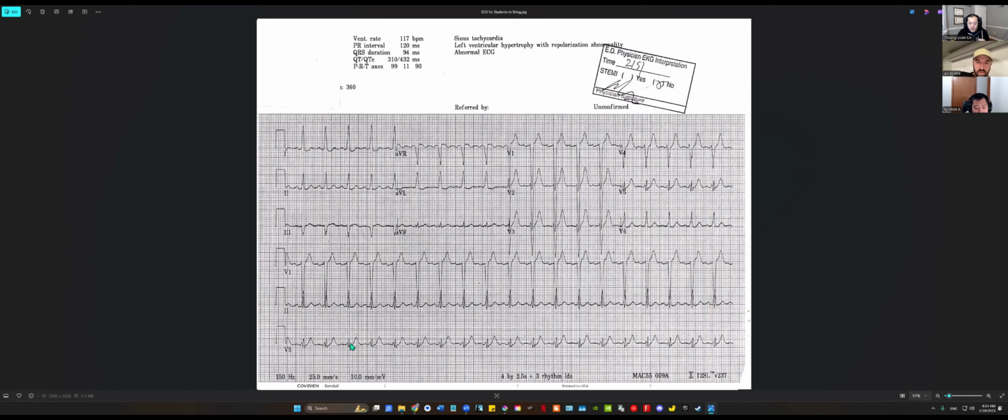So for this one, are you able to see that it lines up with this large line, this heavier line? That means every QRS spike should roughly also line up here. Okay. Anyway, that's an aside.